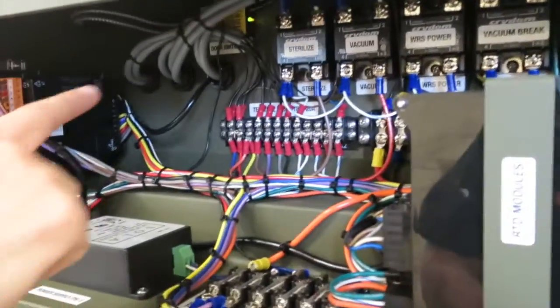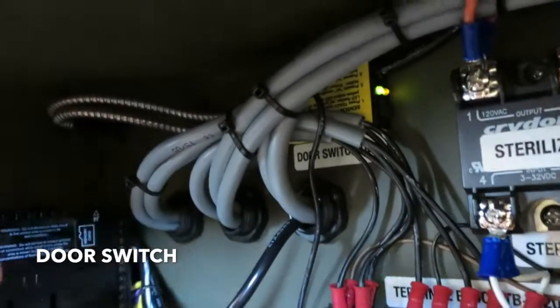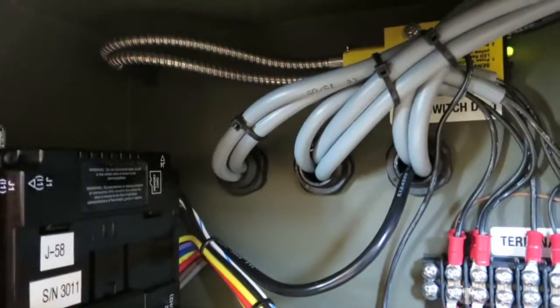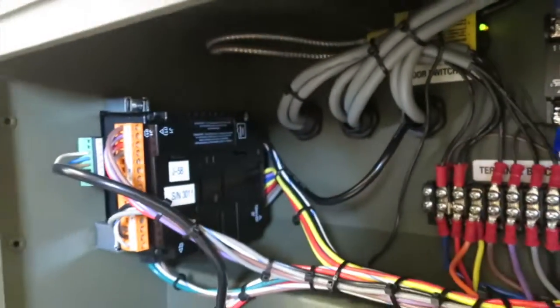Alright, up here to the left we have the door switch sensor. It's this yellow piece with that green LED light on. You'll see these two metal clad cables coming in. That's to protect the fiber optics inside, just to make it pretty durable. So you'll notice there's a pretty big bend there just to protect and not damage those fiber optics. And the wiring comes down and connects to the terminal board, which is then connected to the PLC.